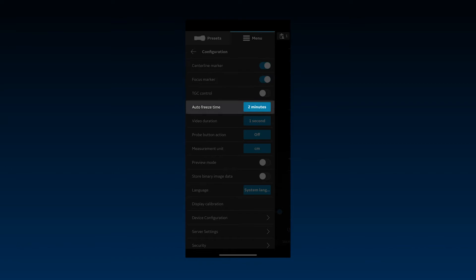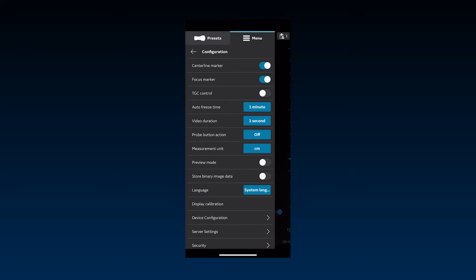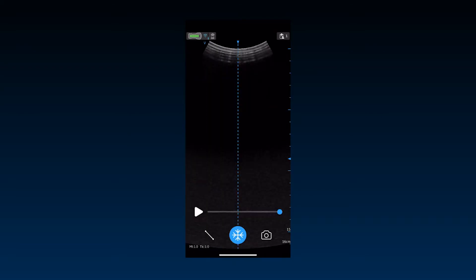Auto freeze time can be used to set the time after which the device will go into freeze mode when not being used, or when there are no user interface interactions on the screen. You can choose between 1, 2, 3, 5, or 10 minutes. It's important to note that a connected probe continues to use battery even when not actively scanning.